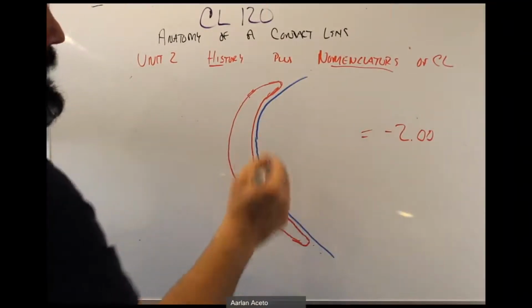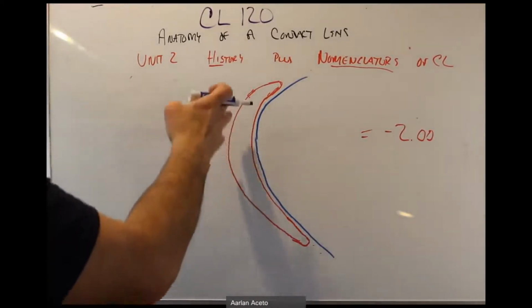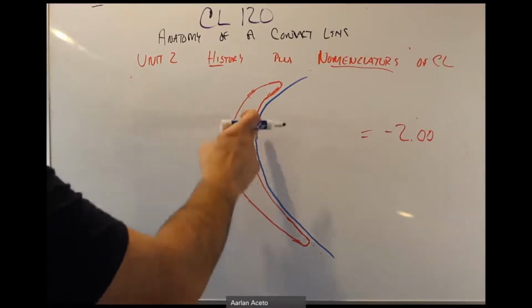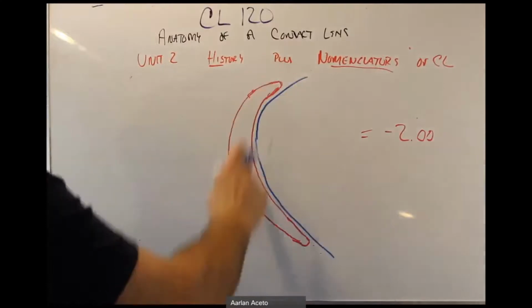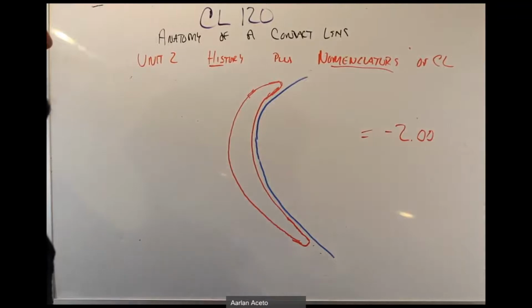the cornea, we do want there every time, remember the lacrimal glands and the accessory lacrimal glands produce tears constantly. They're exposed to the oxygen, and every time that you blink with a gas permeable lens, the lens moves a little bit. When it moves a little bit, it sits on this layer of tear, and there's actually a pumping action where a lot of the old tear that has expended its oxygen to the epithelium, as you blink, new oxygenated tear goes through this. So there's like a pumping method. There's always fresh tear with oxygen coming through and bathing the front of the patient's cornea.